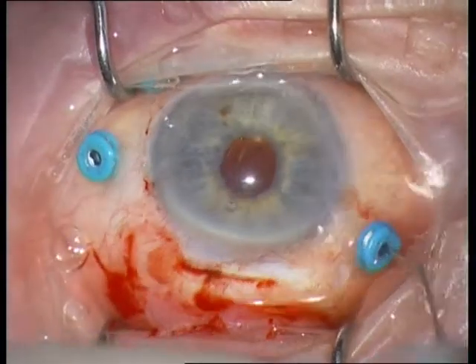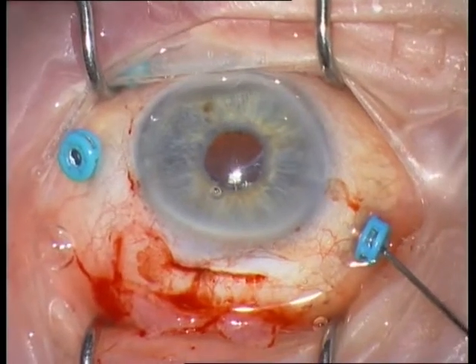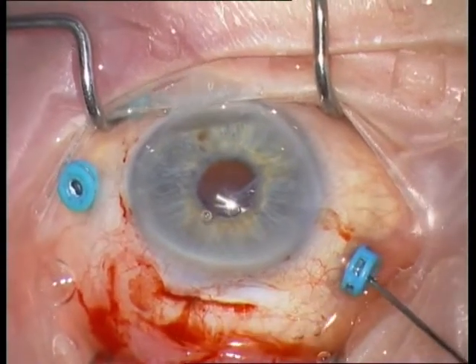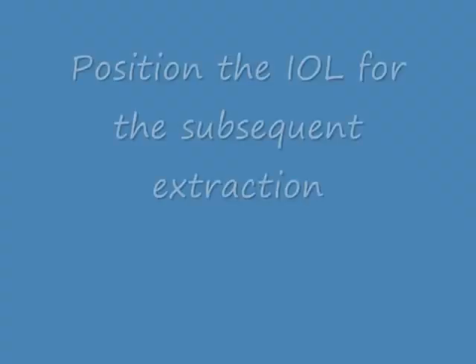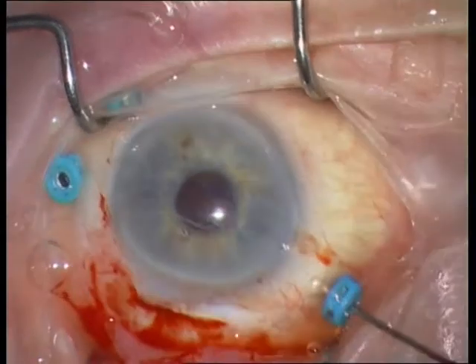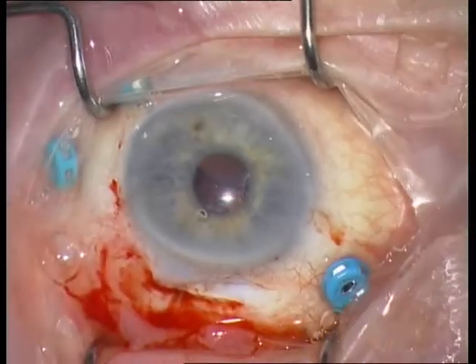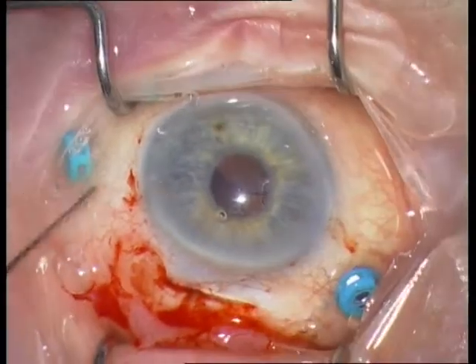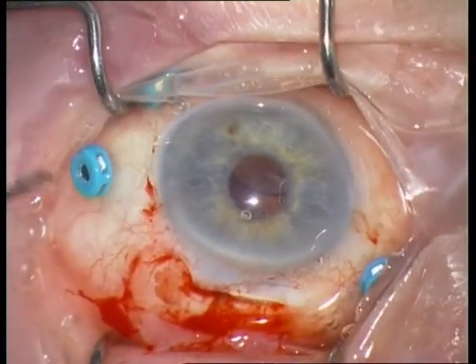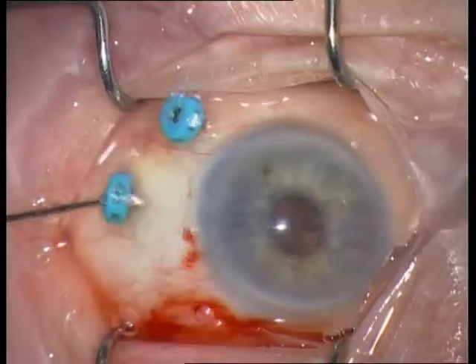This is the viscoelastic cannula, injecting viscoelastics behind the IOL. The IOL is extracted with an intravitreal forceps called serrated jaws forceps.